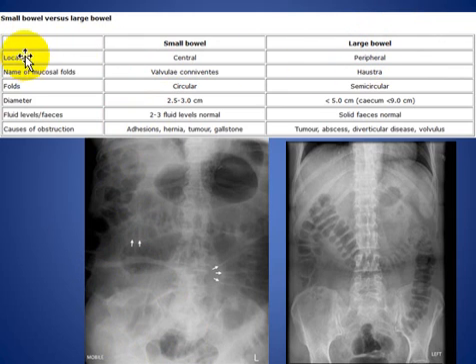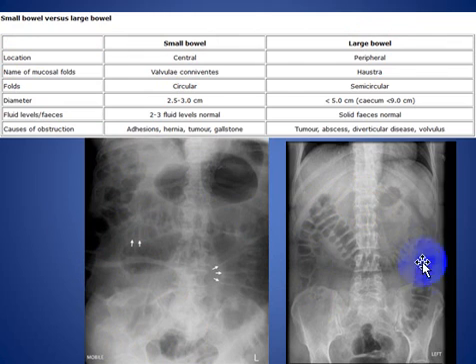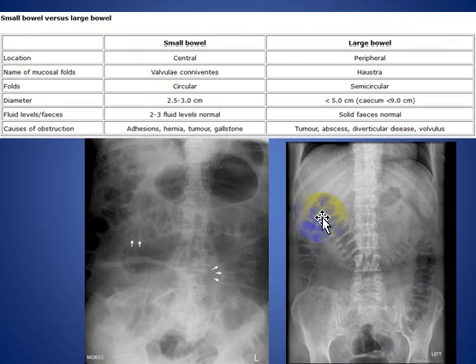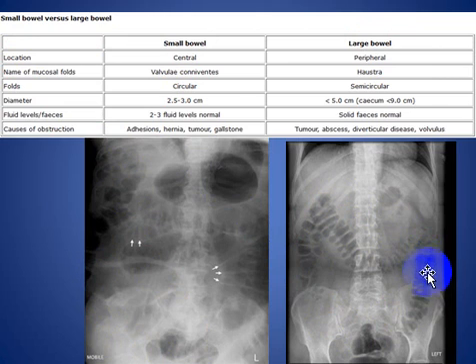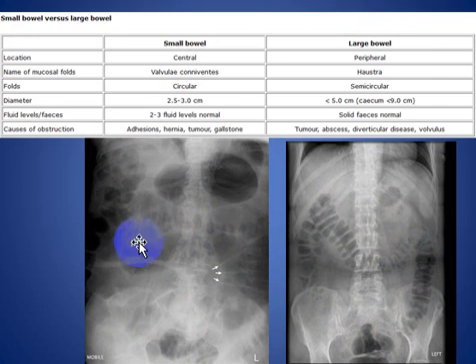First, location. The large bowel is located in the peripheral aspect of the plain abdominal film, and it looks like a frame. The small bowel is located centrally in the abdominal x-ray.